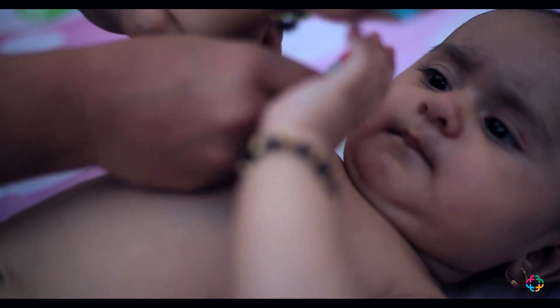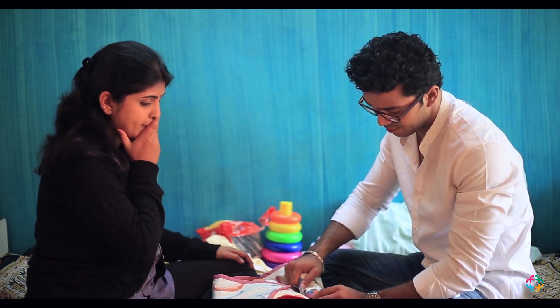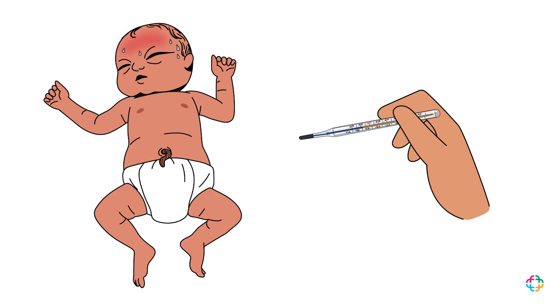The bulb must be in full contact with the skin. Then gently hold the baby's arm against the side of the chest for one to three minutes. If we use a digital thermometer, then we need to wait till it beeps and the numbers stop changing.